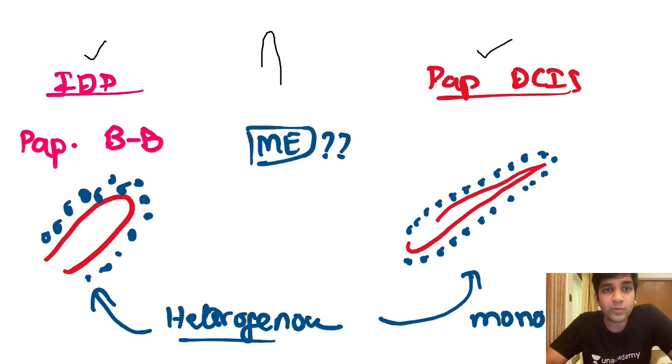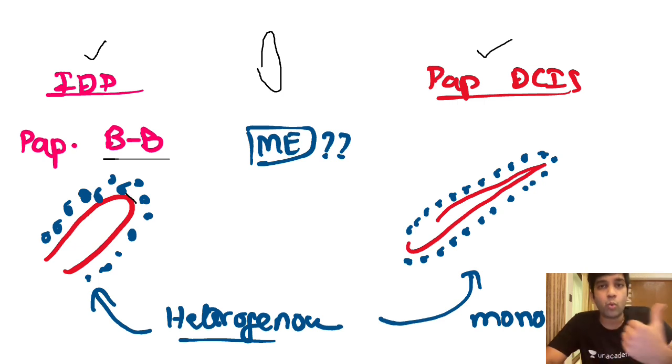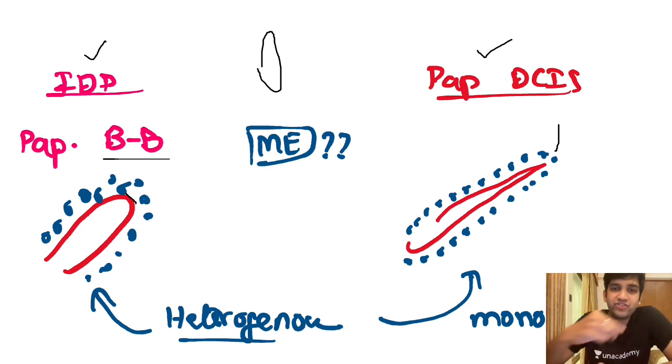In between is an entity, papilloma with DCIS, which will have both of them. See, papillomas will have broad-based papillae. When I say broad-based, you will have a very thick fibrovascular core and it will be blunt like this. What we saw in this lesion, in our case, the papillae is like this, right? It was tapering. It was slender, going like this. We had vessels like this, right?